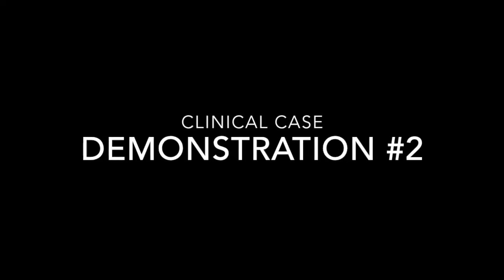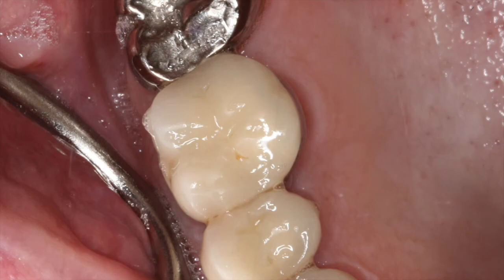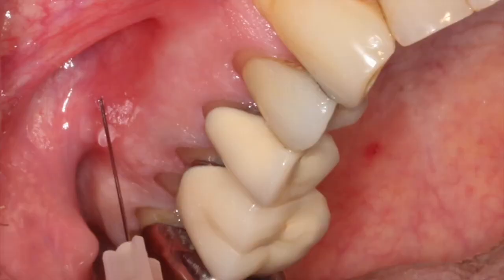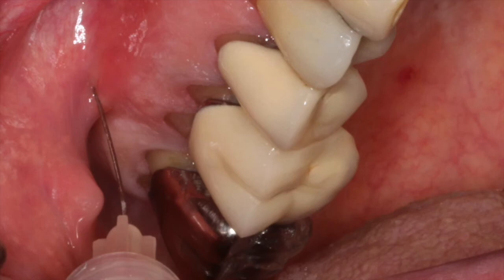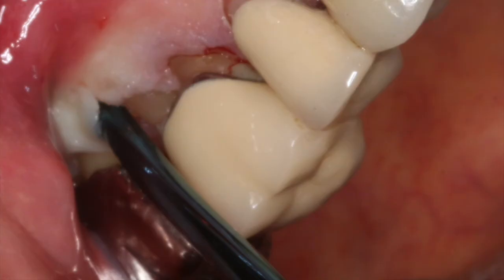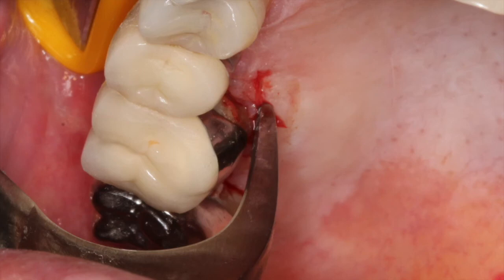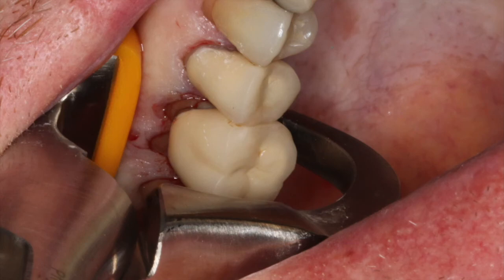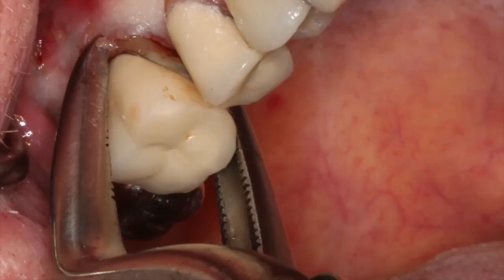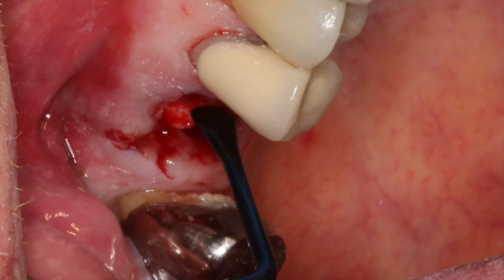Let's look at a second case. We have a non-restorable maxillary molar tooth that we are atraumatically going to remove, as I showed you earlier. This tooth is symptomatic, so we're going to anesthetize the area. Here we're using the Nutra system. I'm using my Golden Dent separators to separate the facial plate of bone from the root of the tooth, then using my Golden Dent physics forcep to atraumatically remove the tooth without damaging the facial plate of bone. We're placing tension on the palatal aspect of the root, placing the bumper as high up the vestibule. The tooth is luxated and removed with a tooth delivery instrument very atraumatically, and we're going to curette those three sockets extensively using our very sharp Golden Dent curette.